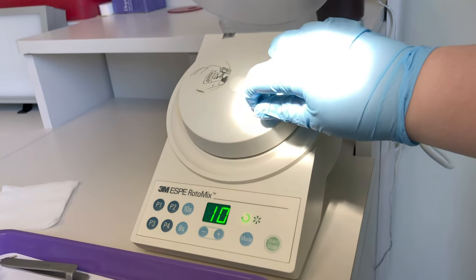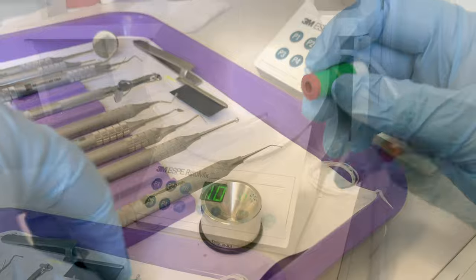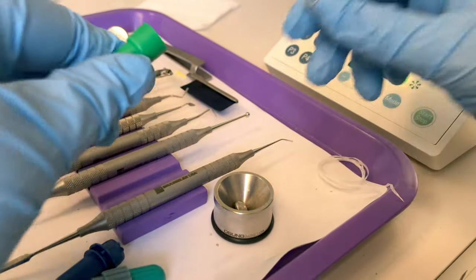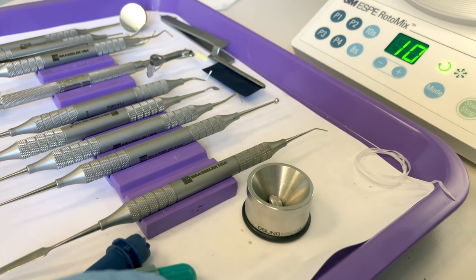When it's finished, lift your lid and remove your capsule. To open your capsule, twist and pull, and let the amalgam fall into your well. Or if you're using a squeeze cloth, let it fall onto your squeeze cloth.